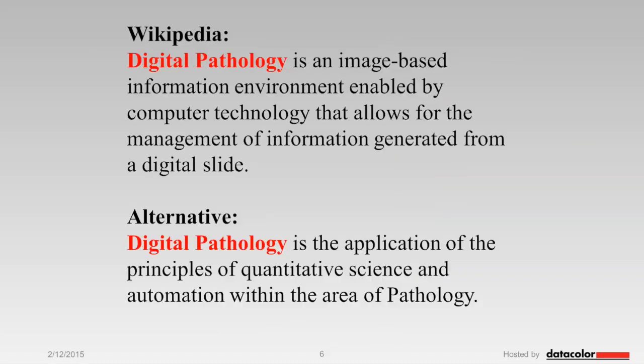First, I want to take a look at the bigger picture of digital pathology. I think it's important that everybody understands why we are somewhat obsessed with having everything calibrated and working as accurately as possible. So digital pathology, if you go to Wikipedia, is an imaging-based information environment enabled by computer technology that allows for the management of information generated from a digital slide.